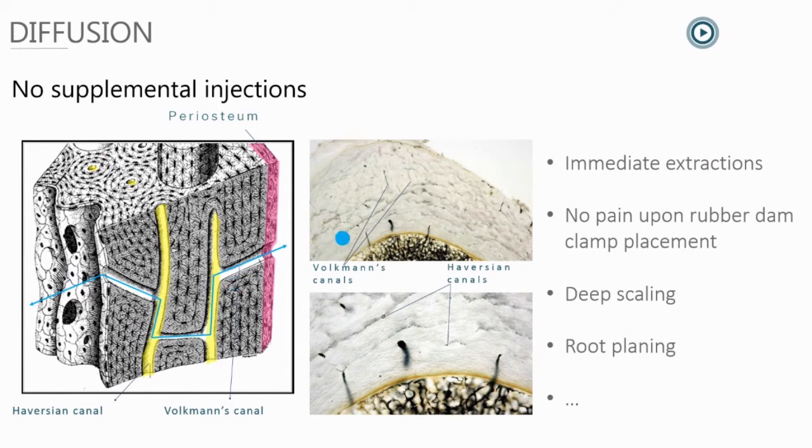Apart from giving you the possibility to treat various teeth with one injection, the diffusion of the anesthetic with intraosseous anesthesia also has other advantages. Indeed, unlike with infiltrations or ID blocks, with intraosseous anesthesia, all of the attached gingival tissues will be completely anesthetized thanks to the diffusion from the cancellous bone through the Volkmann canals and Haversian system.